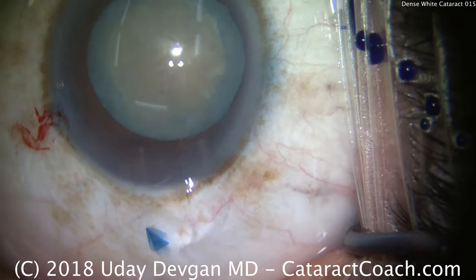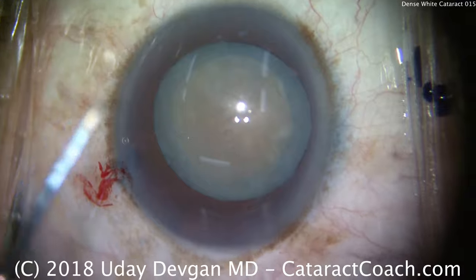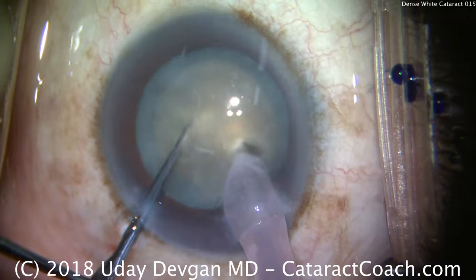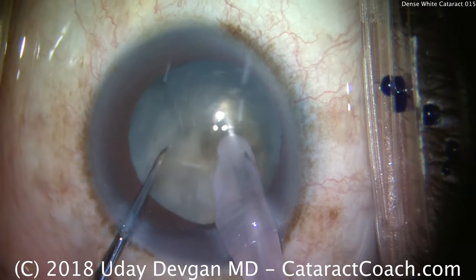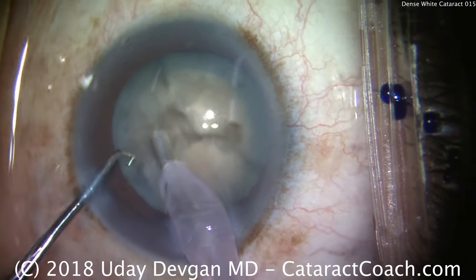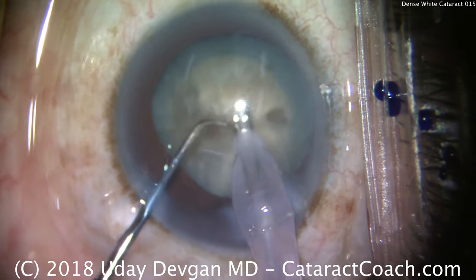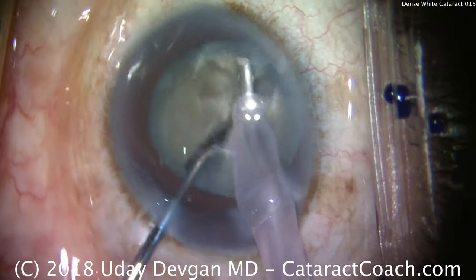More viscoelastic to recode the endothelium, and we'll get our phaco probe. Keep in mind my surgical view is a little bit bigger than your view, so this doesn't go out of my view on my oculars. Here's the chopper and the phaco probe — buzz in, high vacuum, hold the nucleus, and we try to crack it. And that's pretty good. I'm going to buzz in again and chop again — I think we got a quarter free. This is a leathery type of cataract where the material is stuck to itself — hard to separate these quadrants even with those chops. We'll just take our time, buzz in again, and chop, chop, and more chop.